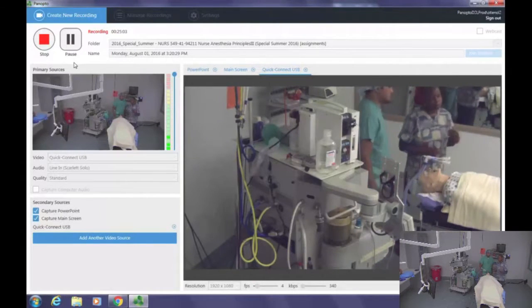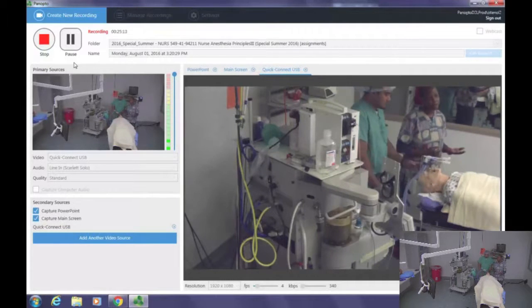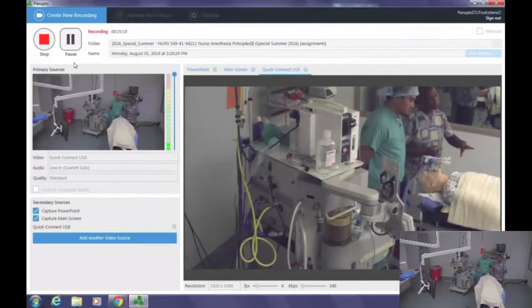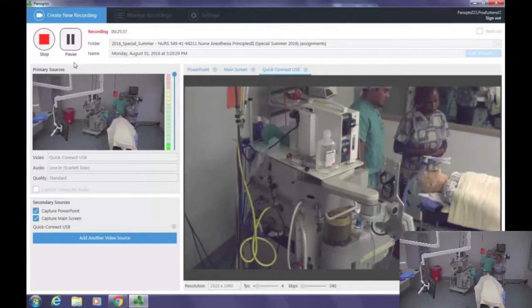The other problem is circulation. Remember, when you place the axillary roll, if you don't place it properly, it can cut off circulation to the arm. It's supposed to be placed slightly caudad to the axilla so that it doesn't cut off circulation. One of the ways you can check once the patient is positioned is the capillary refill, temperature, and color of the fingers, and also you need to place the pulse ox on that dependent arm and check the pulse just to make sure that the circulation is not cut off.